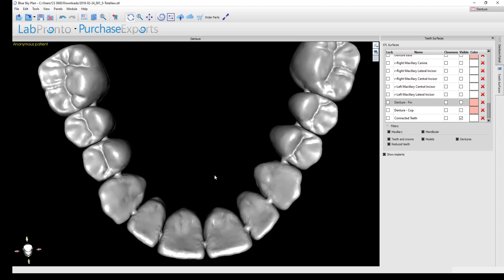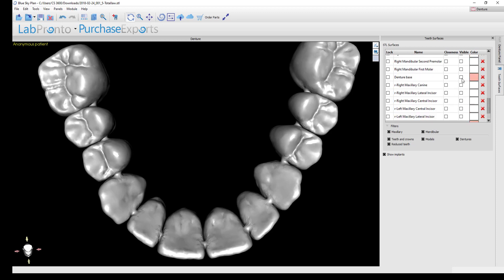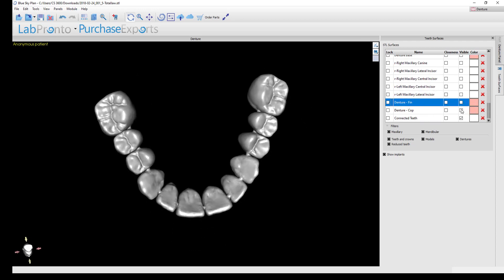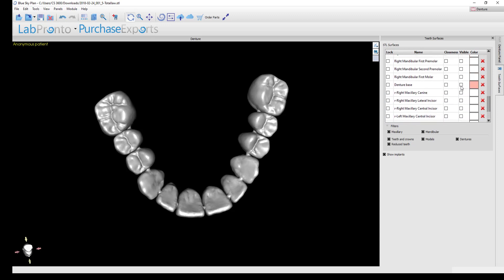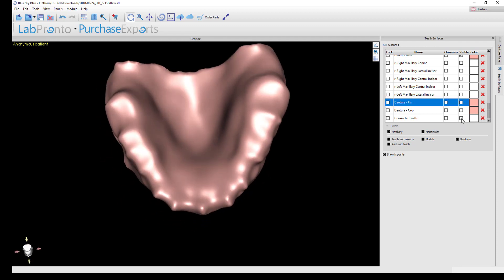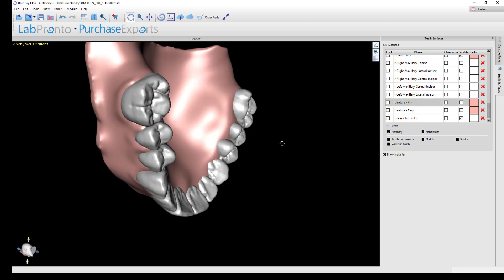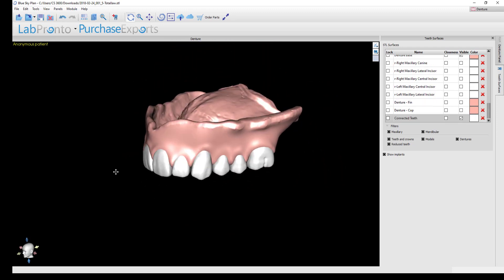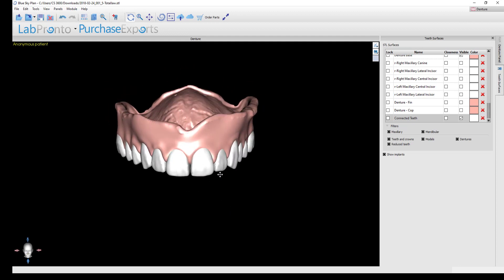Many people prefer a monolithic denture printed in a single material such as a white tooth material with gingiva applied around the necks of the teeth. If you choose that, rather than exporting the trimmed base labeled 'denture-fin,' you would use the one simply labeled 'denture base,' which has no trimming done to it. Exporting the final connected teeth chain together with the untrimmed denture base creates a monolithic denture.